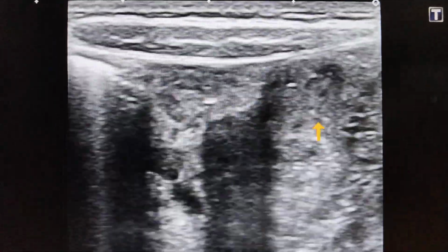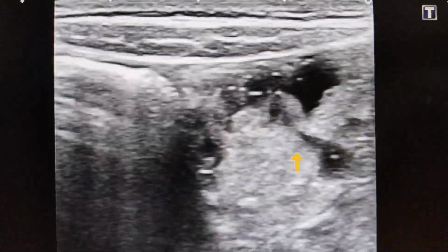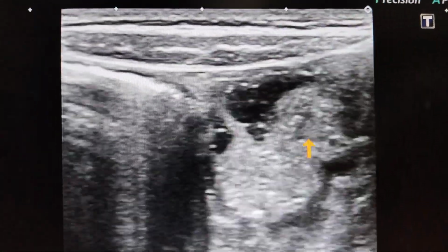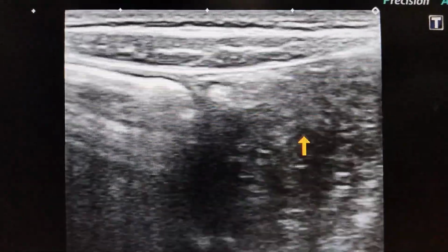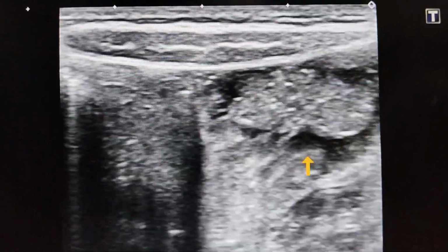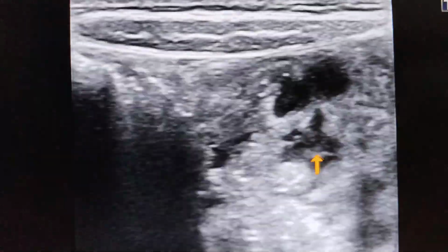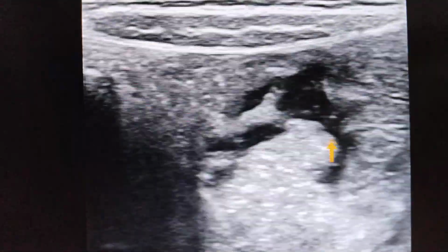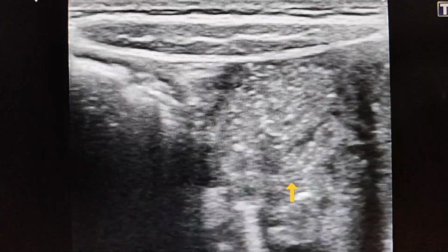As the washing machine washes the clothes with the whirling sign, if you closely observe, this hyperperistaltic movement of the jejunum is also doing the same as the washing machine.